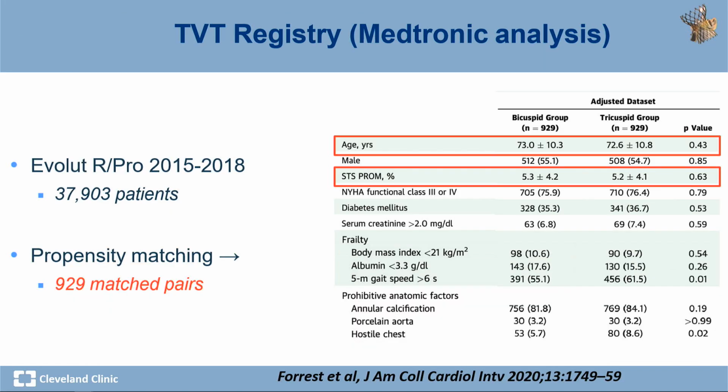And if you go to the self-expanding valves, so this is the Medtronic self-expanding valves. There the patients are a little bit less, 1,000 patients.